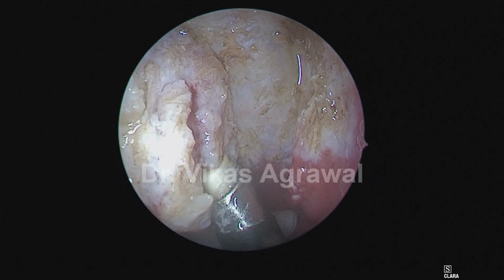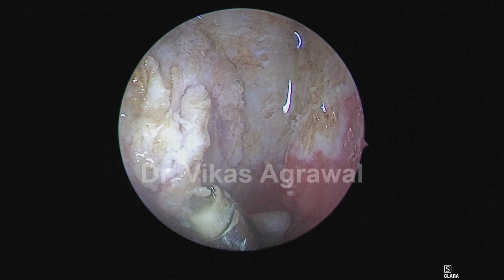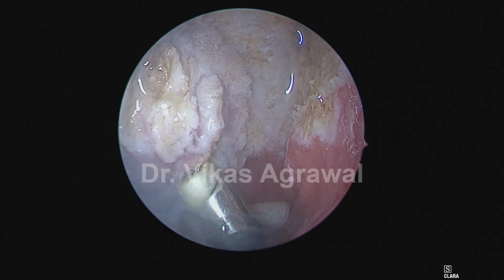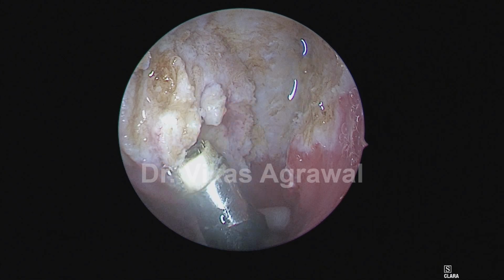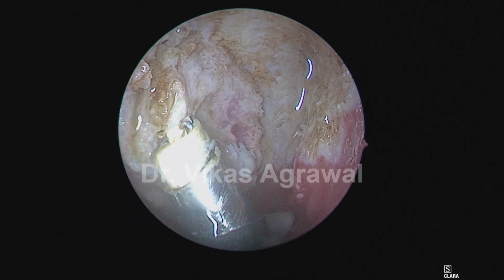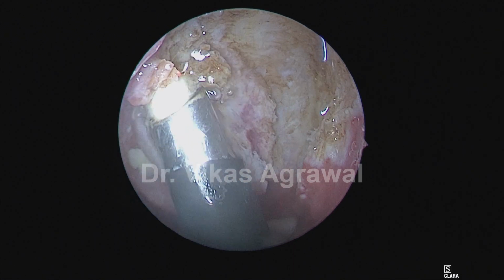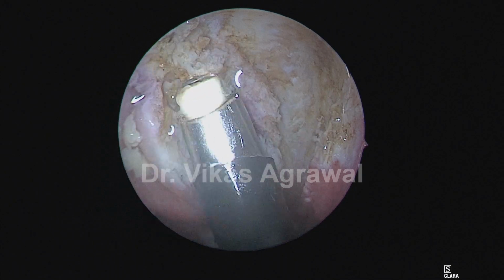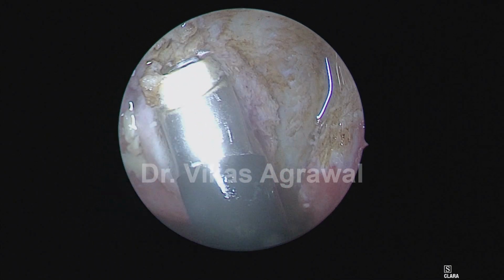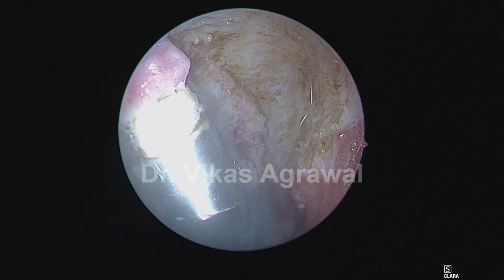Now let me do whatever I can on the right side from here itself, because I can still see a lot of tissues very clearly and I can debulk them. So I'll finish off as much as possible from the left side itself. And you might have realized that I have not taken out my scope even once.